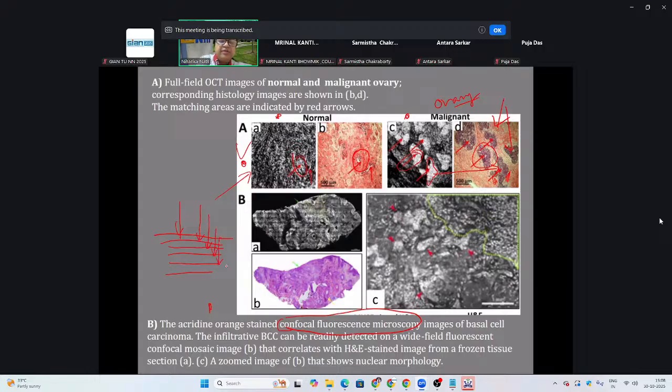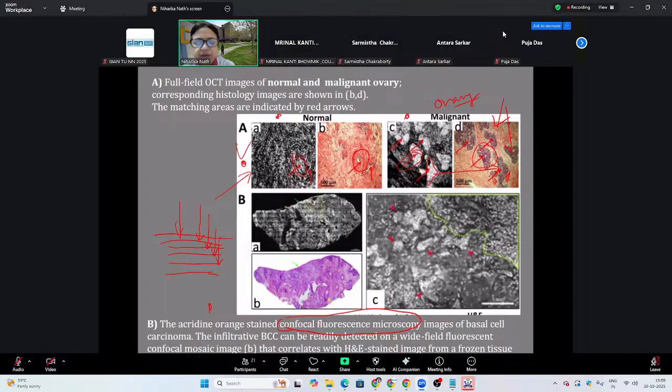I'm not talking about a huge tumor and not a whole human body, but a slightly thicker piece or a slightly smaller piece, and then it will reconstruct. In confocal microscopy, it will reconstruct every layer, and give you an image that is not a 3D image. It still looks like a slide, but it'll have reconstructed. So it's not going to give you a colorful 3D looking image, but it will give you a basic idea of it.